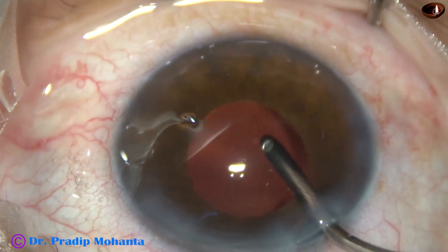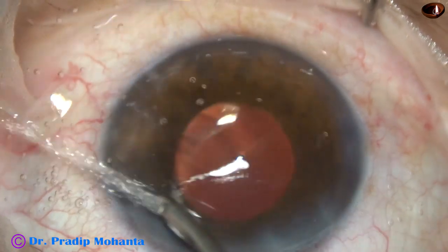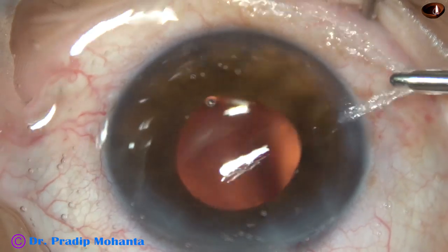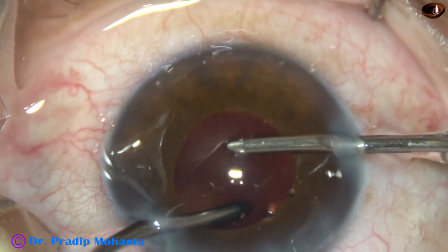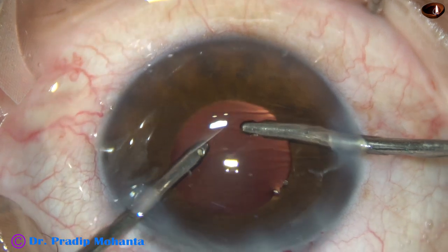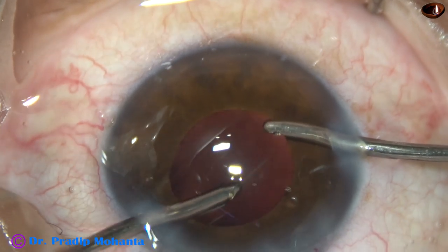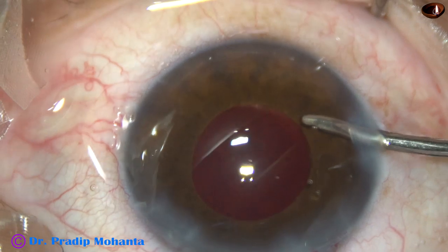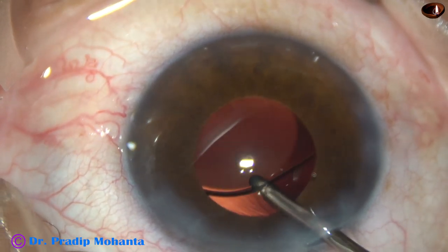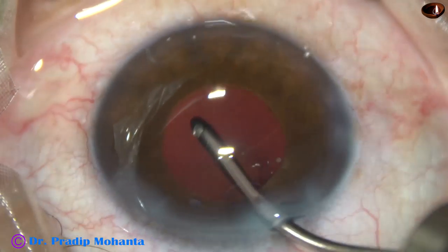Cleaning of viscoelastic substance should be very thorough if we have used visco for implantation of the intraocular lens. If it is hydro implantation we can save this time, but if we have used visco, removal should be very thorough. Bimanual irrigation aspiration is being used for cleaning the visco from the anterior chamber, posterior chamber, and from behind the iris. Then I use irrigation only and go behind the IOL and irrigate the capsular bag very nicely so that all the visco from the capsular bag comes out.